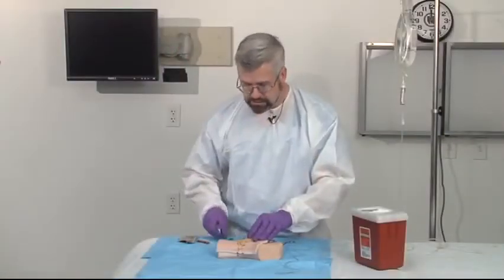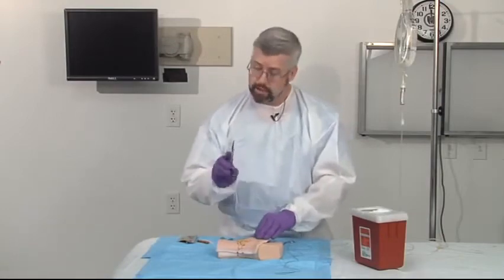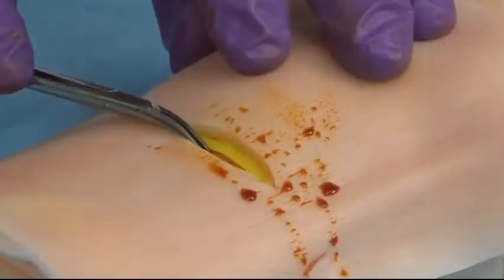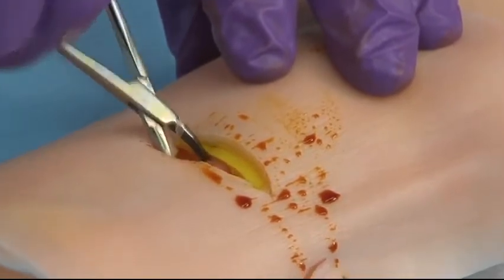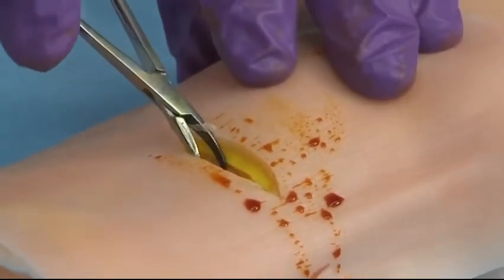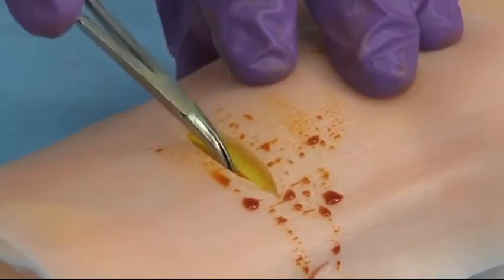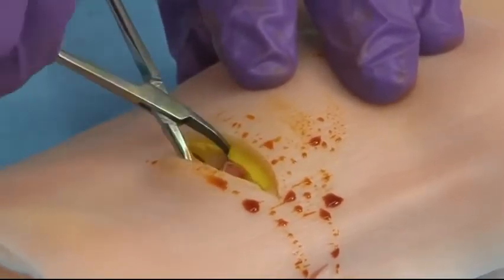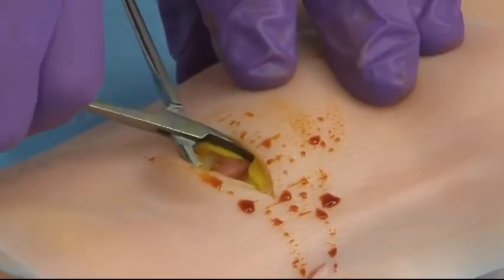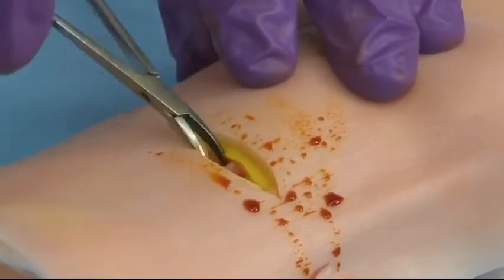Once you've made your incision through the skin and subcutaneous tissues, the key is to take your mosquito clamps, pushing down against the bone, and trying to run in line with the vessel right against the bone. What this does is actually divides that subcutaneous tissue. The goal here is you're trying to isolate the vein on either side, so I'm spreading on either side of where I think the vein is, and I'm actually beginning to see it come into view.